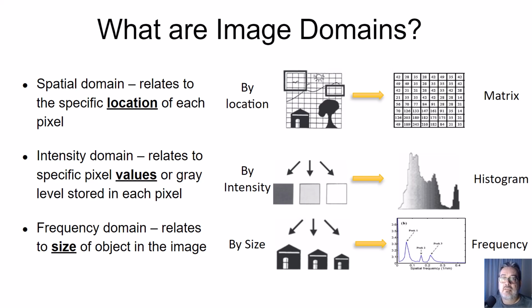What are they? Digital image information can be broken down into different domains. There are 3 image domains. And the spatial domain is primarily what we've been talking about so far in this course. We're most familiar with the spatial domain in digital radiography. In this domain, the matrix is comprised of numerical values representing grayscale.